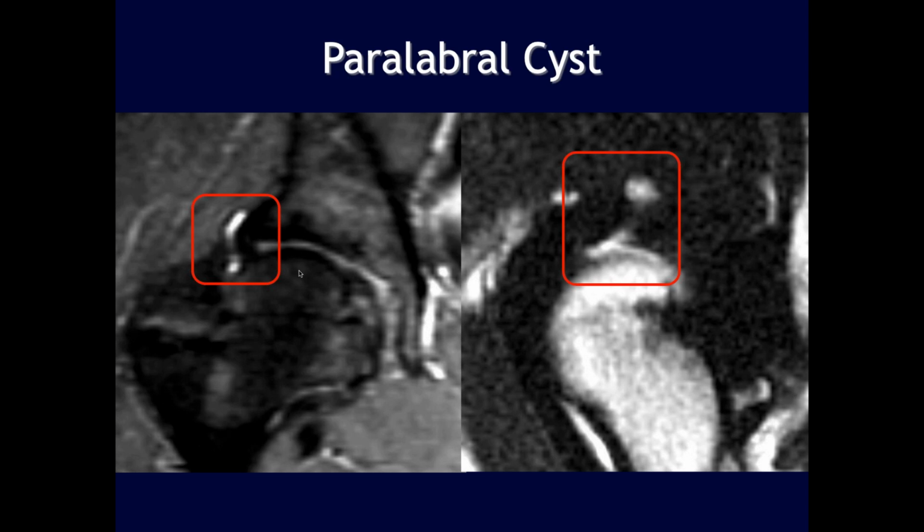Now we have much better quality imaging, and I don't think we need, most of the time, to do arthrography of the hips looking for significant labral tears with today's technology. Some people would disagree with that. Is it just the way the acquisition is, or is there coxa vara deformity and frank deformity of the femoral neck there? I would not be willing to call that on these small fields. I'd like to see a larger field of view image.